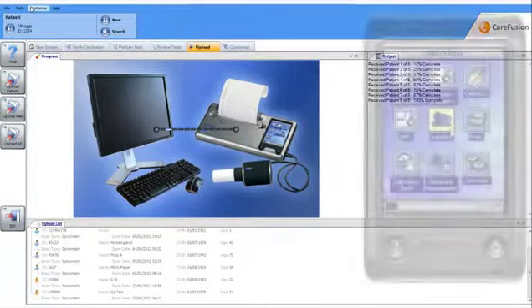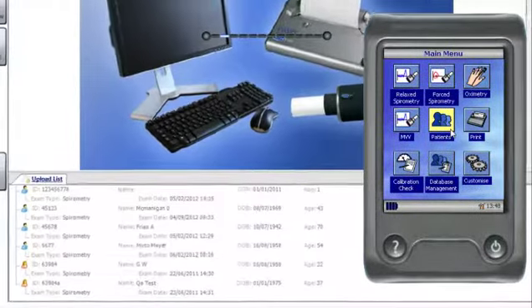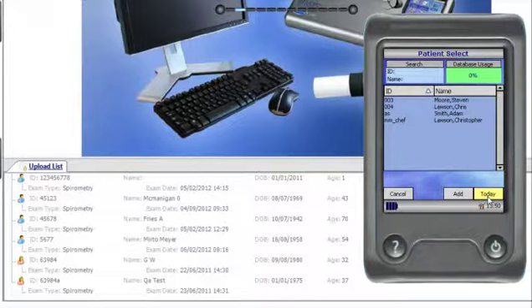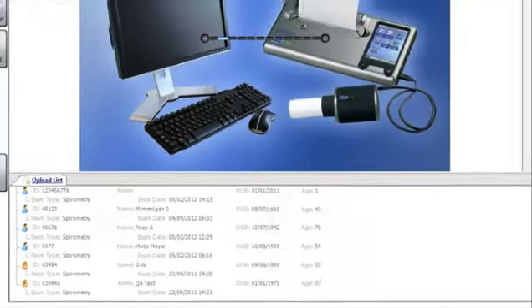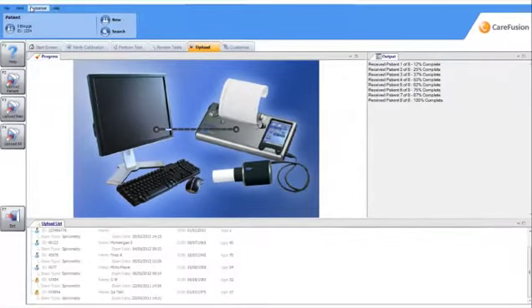To view the list in the spirometer, simply select Patients and then Today, and those patients downloaded will be listed. Note here that only patient demographics are downloaded to the unit. This is a useful feature to avoid having to enter patients' details into the spirometer if they've already been entered into the SPCS software and if a specific group of patients is to be tested for a clinic.